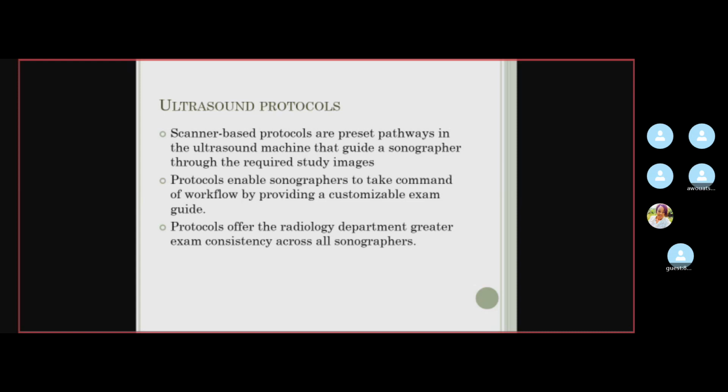There is an option on the touchscreen or the monitor console to select the transducer. For the abdomen we select the curvilinear transducer, and then we can start the scan. These protocols are important because they help sonographers take command of the workflow by providing a customizable exam guide, and they offer greater exam consistency across all sonographers.